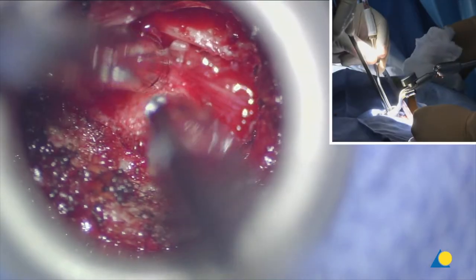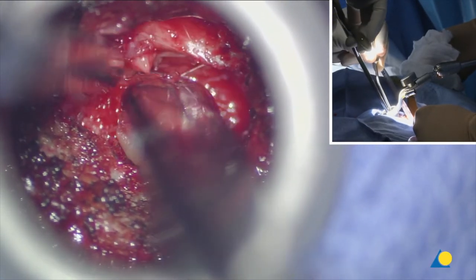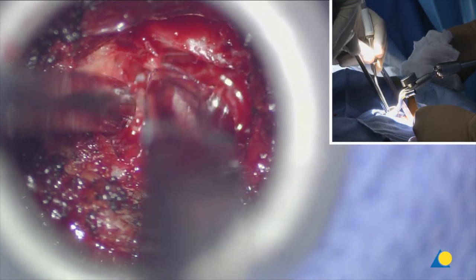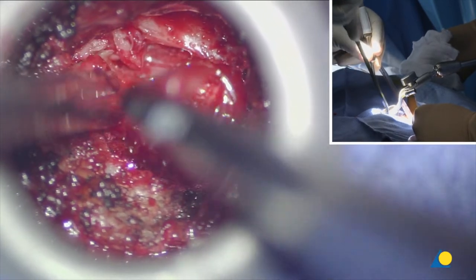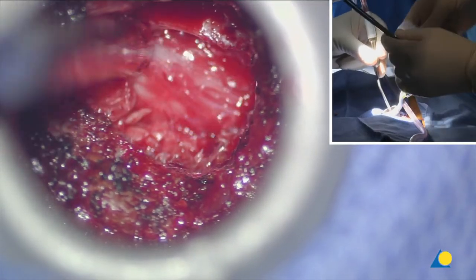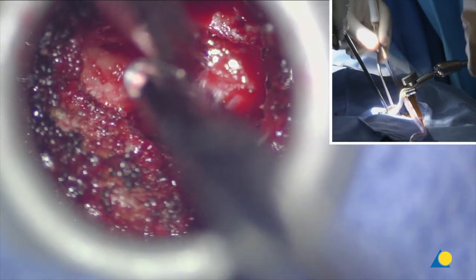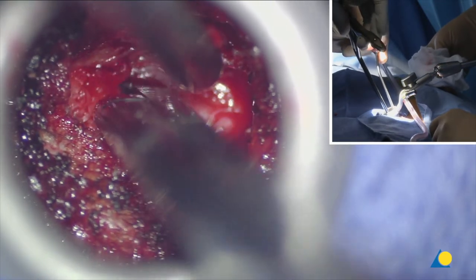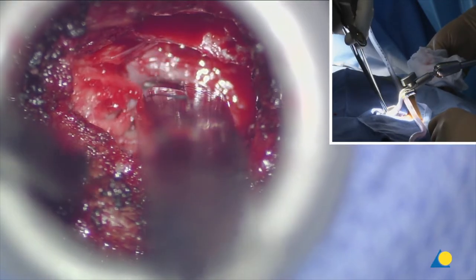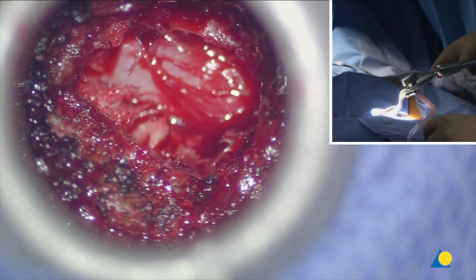Now we're going caudally, removing ligamentum flavum. The reason I do this is because I want to look at the dura to better understand how far medial and lateral we are. Now we're removing the ipsilateral yellow ligament and we've got nice exposure of the ipsilateral dura.